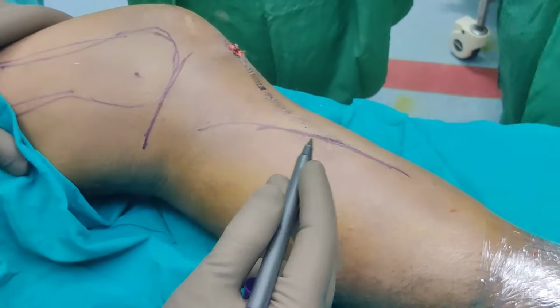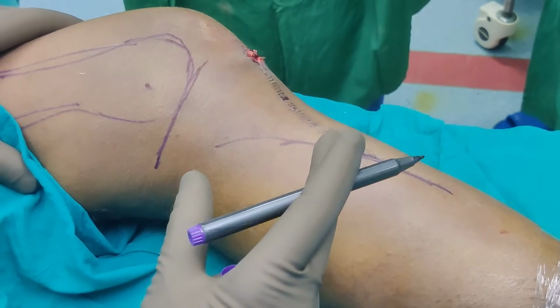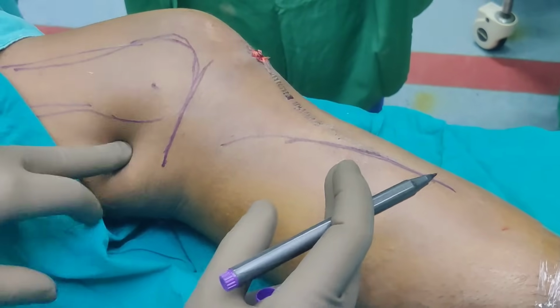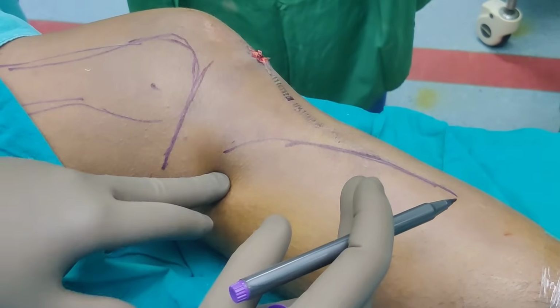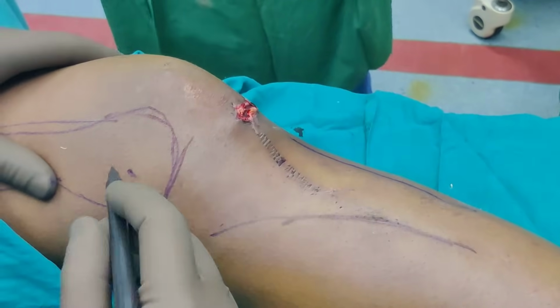Now if you are using a medial approach for a medial plate for this fracture, because mostly the fracture is in the sagittal plane and the posterior part is very little, we don't need to buttress the posterior part. That is why we are using this medial approach to buttress the medial fragment.